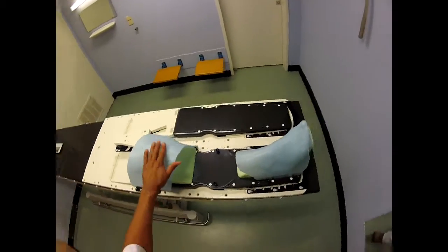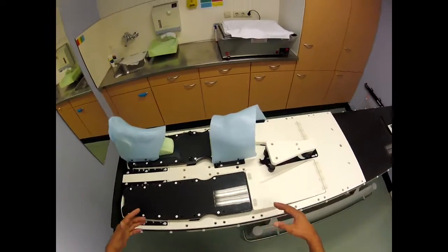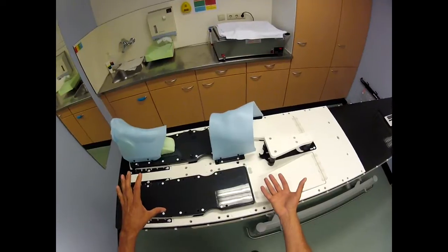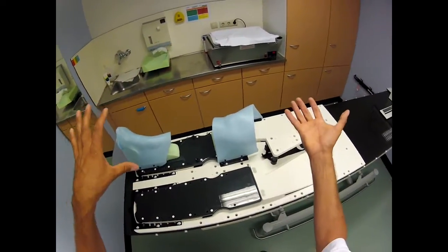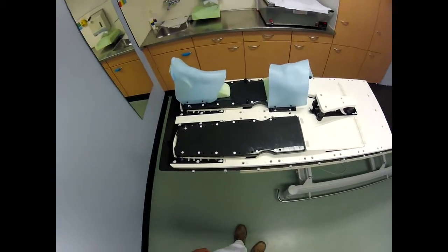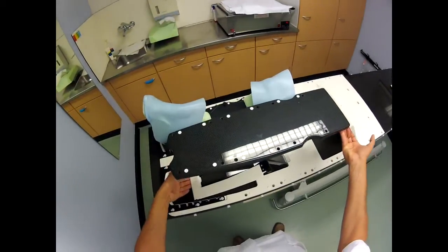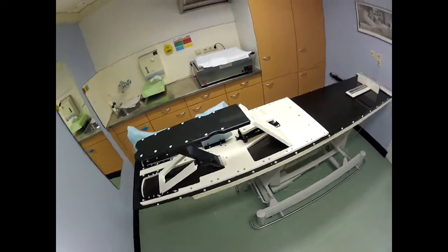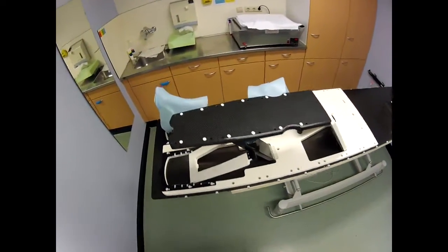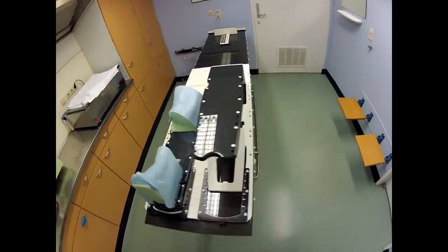When we use our multi-fix and our doctor says 'I want this leg back up,' I normally have to make things out of polystyrene. Not anymore — the only thing I have to do is this, and there she is. It's easy, no sweat, and it's stable. It looks nice.